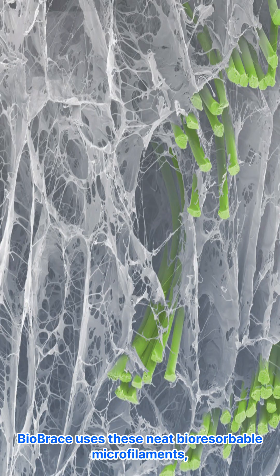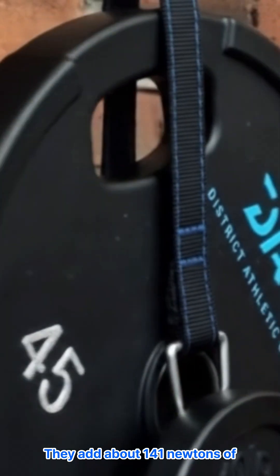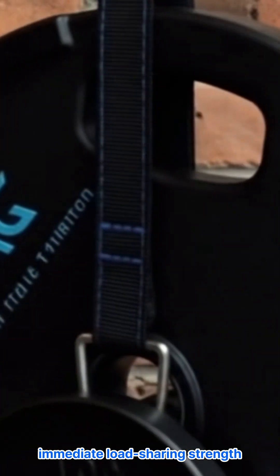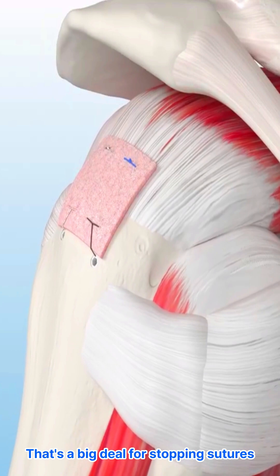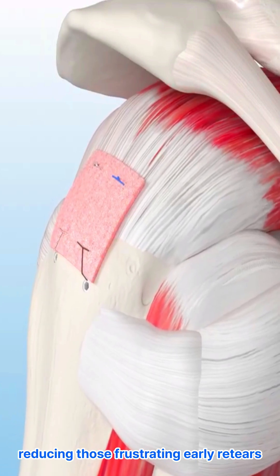BioBrace uses these bioresorbable microfilaments, kind of like tiny bits of rebar for your sutures. They add about 141 newtons of immediate load-sharing strength. That's a big deal for stopping sutures from pulling through tissue, reducing those frustrating early retears.